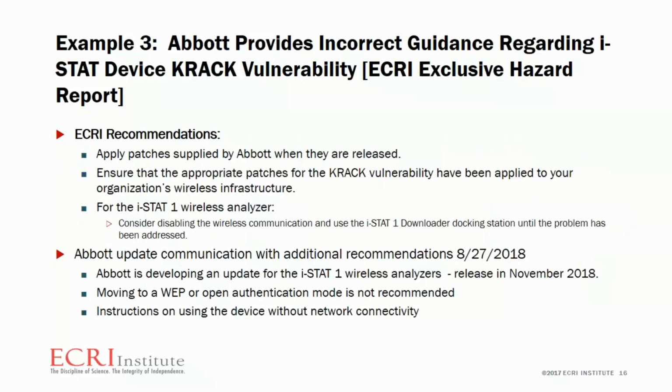We worked with Abbott in terms of our recommendations to move forward with, to apply patches whenever Abbott released them to fix the KRACK vulnerability. Ensure also that any KRACK vulnerability patches are mitigated in your overall wireless infrastructure, which doesn't void the problem, but it definitely takes care of the other half of the coin.